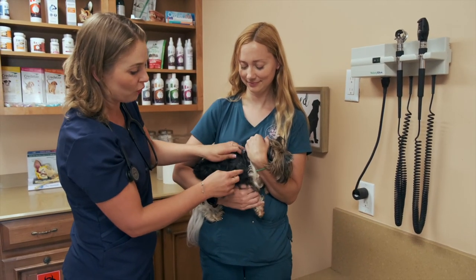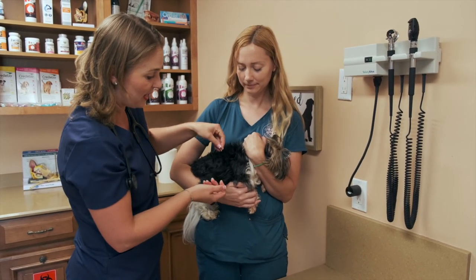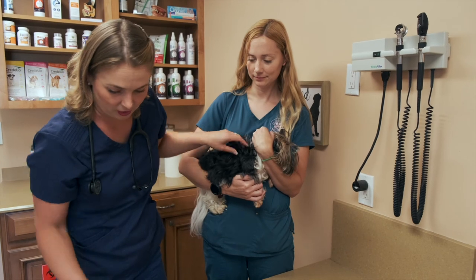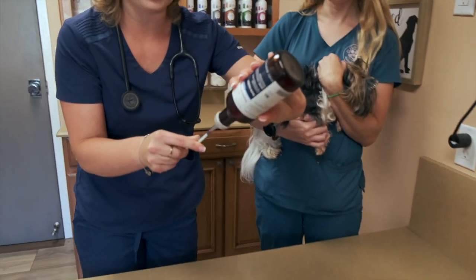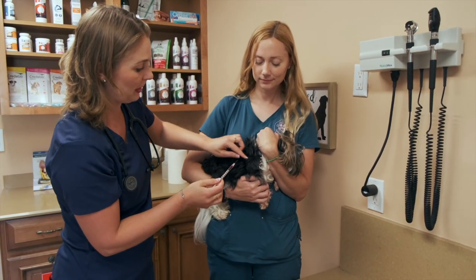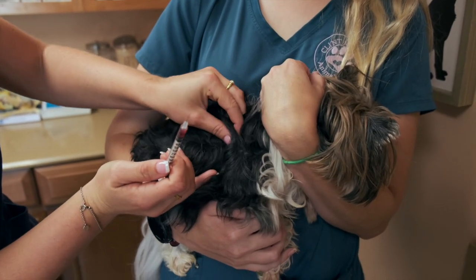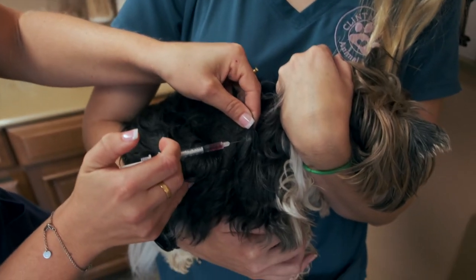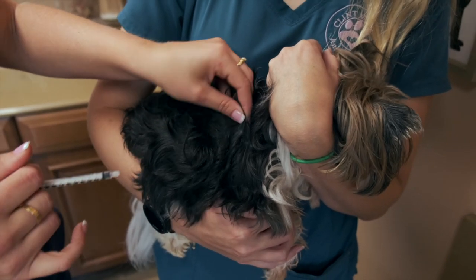I'm giving this sub-q shot in Mimi's shoulder area under her fat. Unlike the pit bull where you could easily see the skin, this dog has hair, so you have to palpate, feel, and lift up that skin. I draw up a little B12 and I part the hair so I can see the skin, pinch it and lift up. I stab right in where the hair is parted and inject it, then pull out. I rub it afterwards just to be kind.